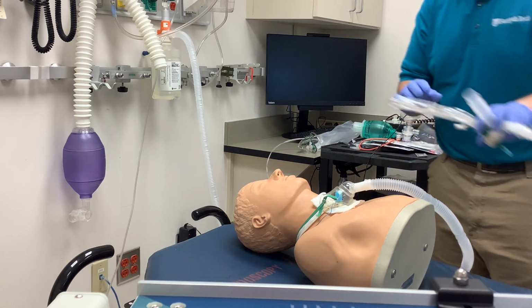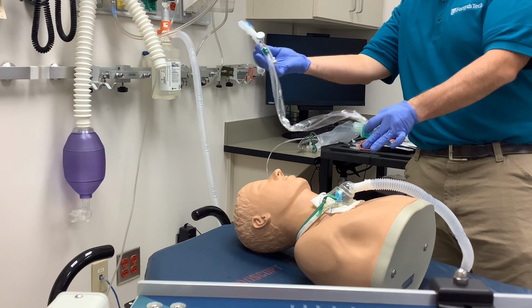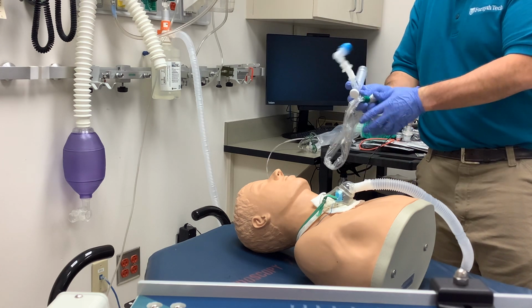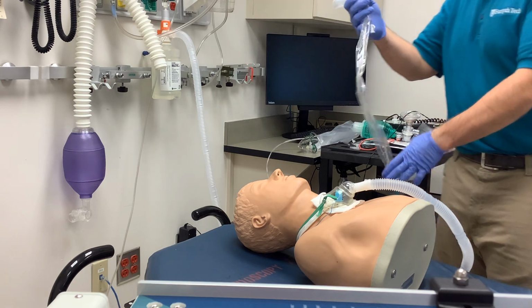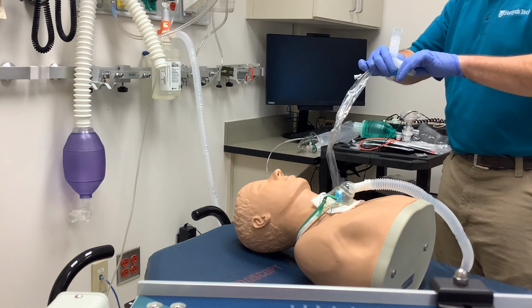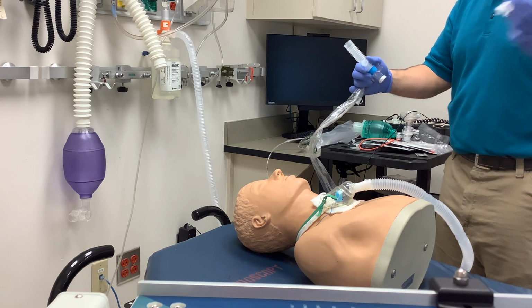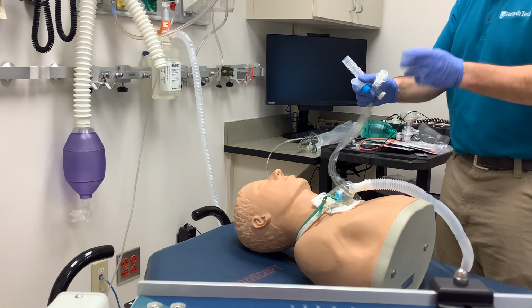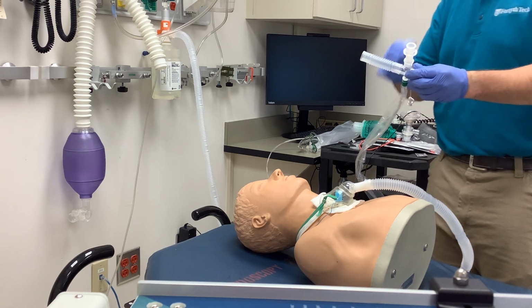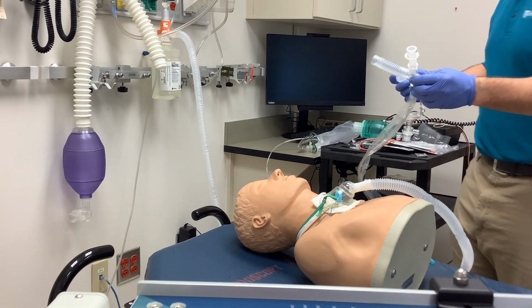So you can go get a brand new Ballard suction catheter. Make sure that it's set up and ready to go for suction. I've got it capped. It comes packaged separately, but here's a little piece that's an Omniflex. So you can take your Omniflex and go ahead and put it in there. It's just going to give you a little bit of flexibility with attaching the suction catheter to the tracheostomy tube.